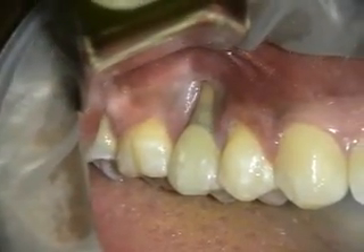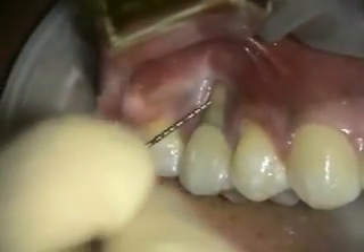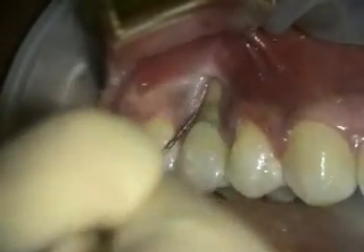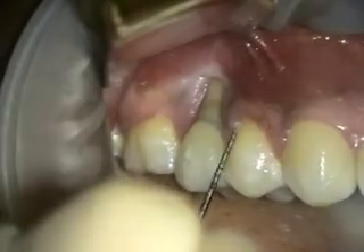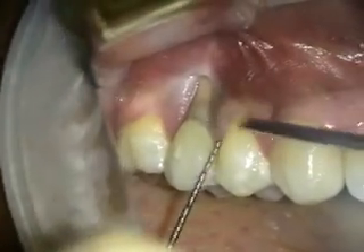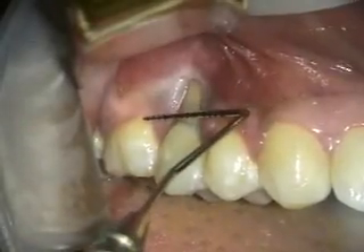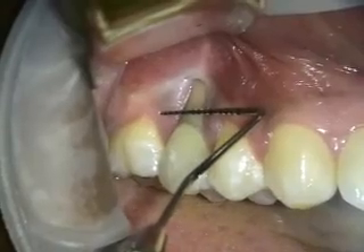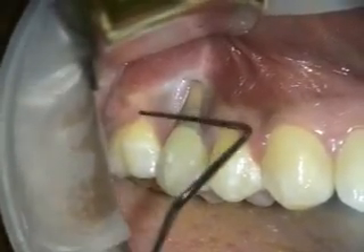Today we're treating this localized to severe recession, and I think it was kind of a result of some factitious habit on this tooth. You can see that it's real clean, so that's good. We're going to be putting some alloderm under here, coronally positioning this, and I don't expect we're going to get full root coverage, but hopefully we'll get at least three quarters.